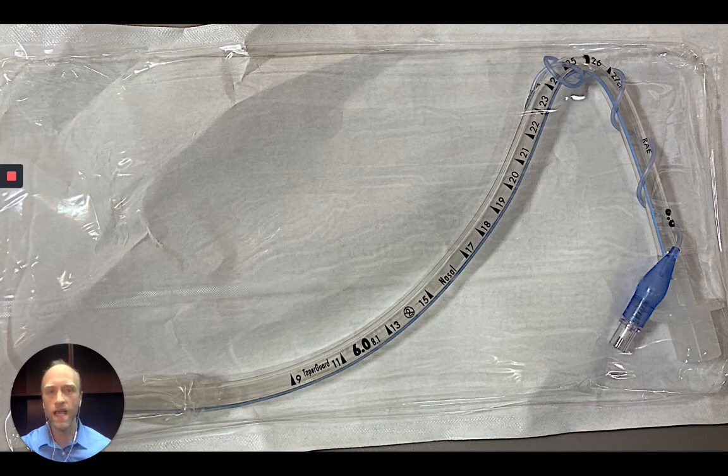I heard of a recent case in which a tall patient was intubated using the nasotracheal route, and the ET tube was under some tension because the tube was just a bit too short for this tall patient. And then due to that tension, the ET tube adapter popped off and the ET tube itself receded into the nasopharynx. Talk about an airway nightmare. So I like to have some of these extra long tubes designed for nasotracheal intubations available in the ED for such cases.